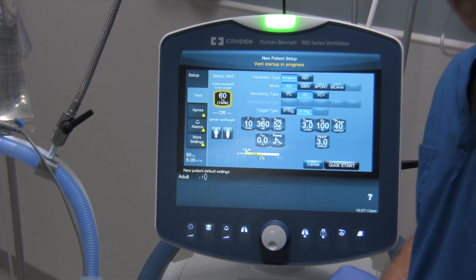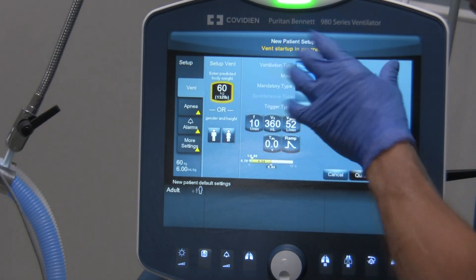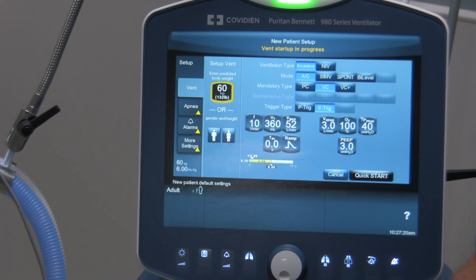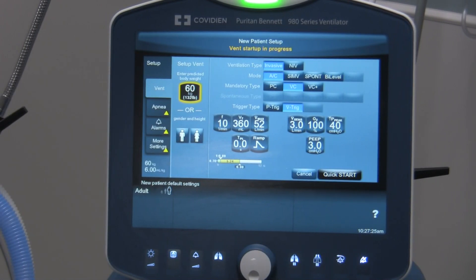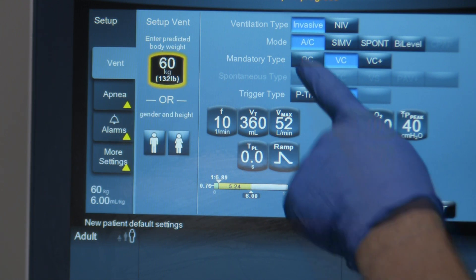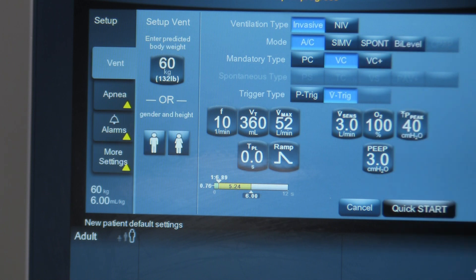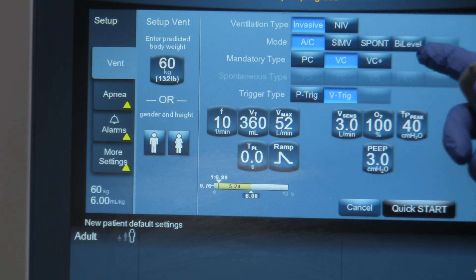As soon as I do that, the ventilator comes up with some values based on the default settings. Looking closely at those defaults: it allows us to choose the ventilation type — invasive or non-invasive. The next thing is the style of mode we want to ventilate with. The choices are assist control AC, SIMV which is synchronous intermittent mandatory ventilation, spontaneous ventilation, or bi-level.